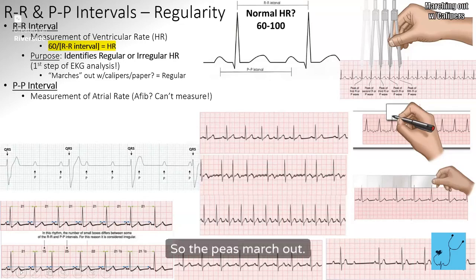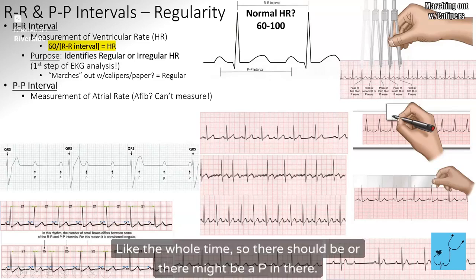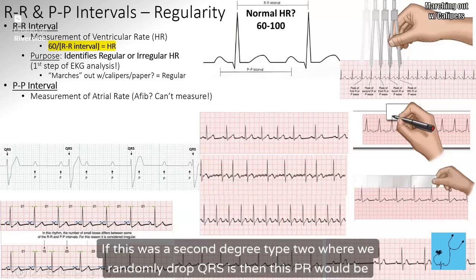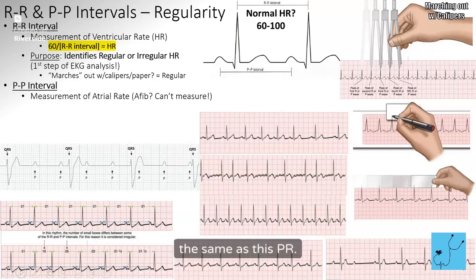So the P's march out the whole time, so there might be a P in there. The PR intervals that we can see are all different. If this was a second degree type 2 where we randomly drop QRSs, then this PR would be the same as this PR, right? Good.